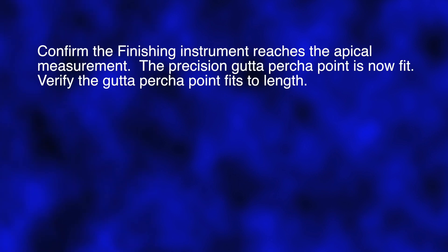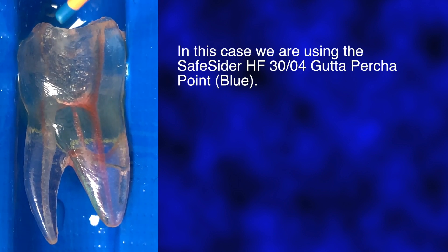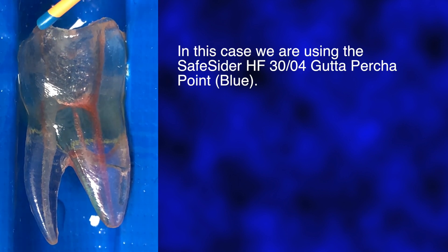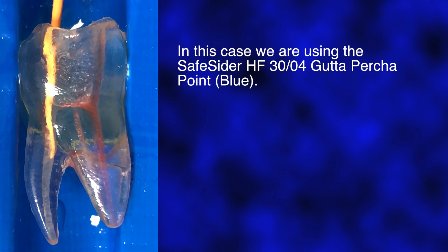Confirm the finishing instrument reaches the apical measurement. The precision gutta-percha point is now fit. Verify the gutta-percha point fits to length. Pre-fit the SafeSiders HF3004 Master gutta-percha point to ensure the point fits to length. In some cases, you may need to select the SafeSiders HF2504 point if working length is not reached with the 3004. In this case, we are using the blue 3004 point, which fits most of the time.